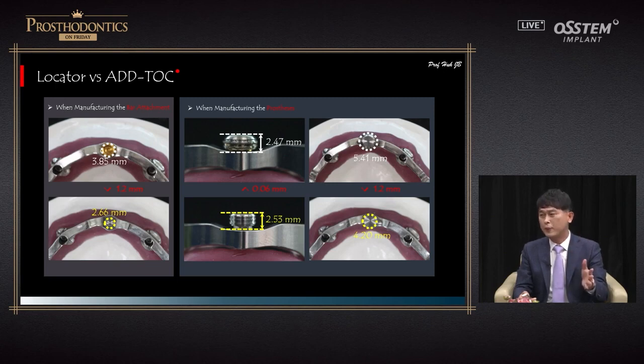Why are holes made in the locator? When a locator is completely attached to a bar, it is elastic, so it is pressed down. When you open your mouth, it detaches itself a little bit. The vertical force is directly applied to the plastic. So if you do not attach it properly, the vertical force will be concentrated on the locator. So the ADD-TOC attachment has some gap, so that vertical force is not directly applied to it.